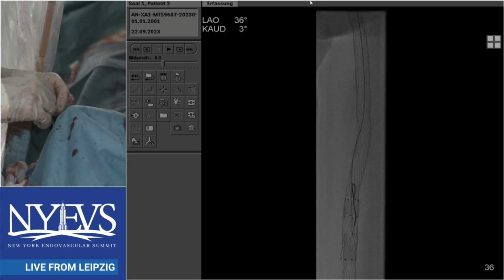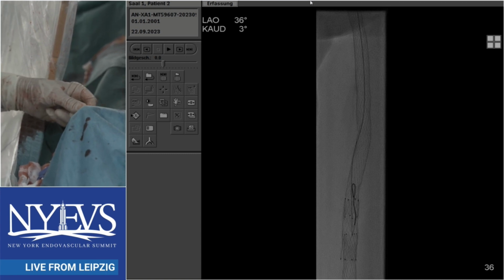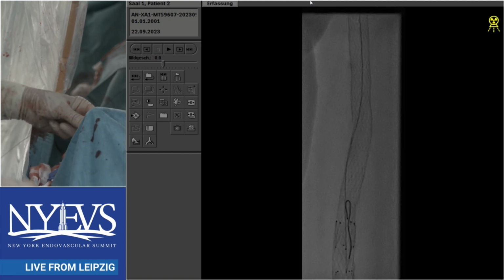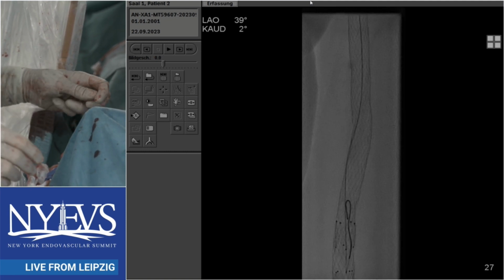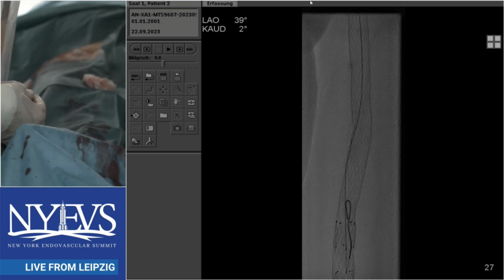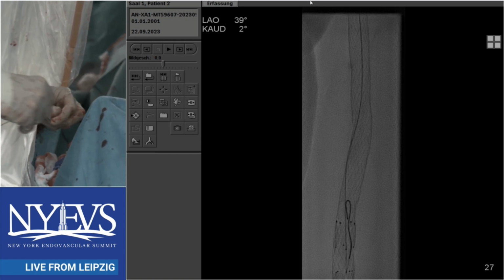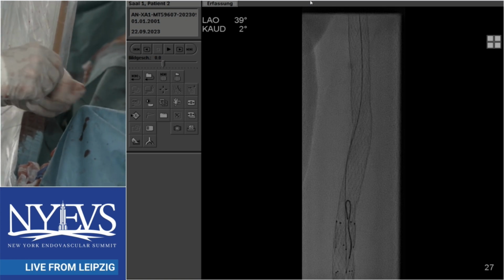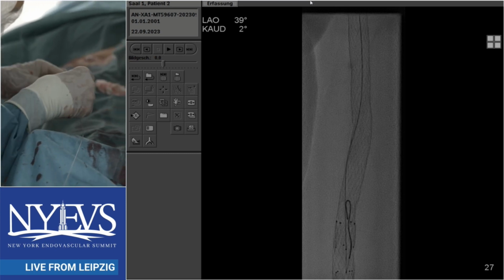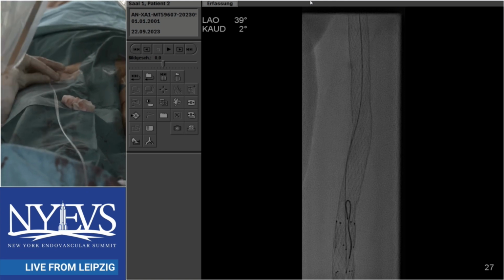Sorry, I have to wait for a balloon. So Andre, it's PK. How are you? Great case. Now that you're dealing with this fracture, the issue here is going to be with the Rotarex. I know you're going to cross this. Are you concerned with running the Rotarex through this fractured segment? Because obviously you have a lot more experience than we do here in New York with Rotarex. We've just started using it, but we've been relatively avoiding using Rotarex in these fractured stents, especially in the fractured segment. I was just wondering on your thoughts on that.